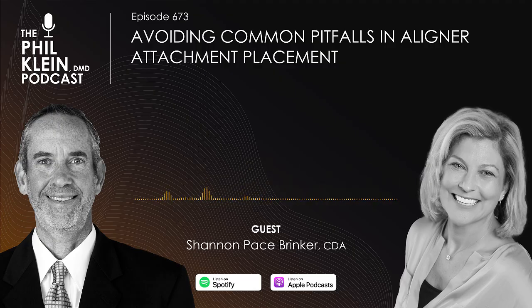Does low speed suction work well with OptraGate? You don't even need it. Can I tell you, I don't even put a suction in the mouth. Once I lay that patient back in the chair, this just keeps the lips off the teeth and we're ready to rock and roll. So I don't have any kind of suction in there at all, unless I'm going to rinse out, of course, or whatever.